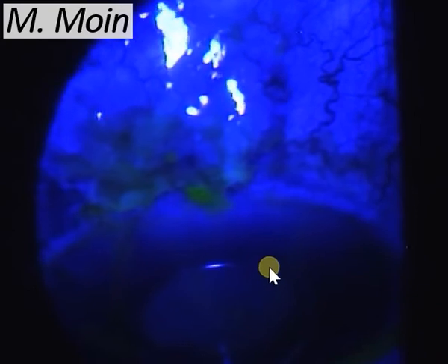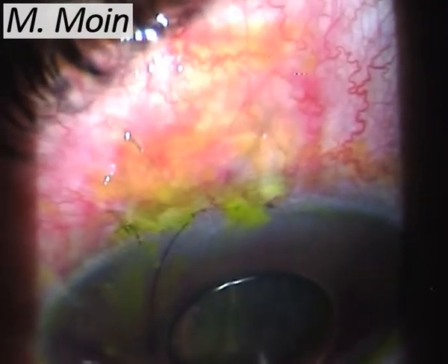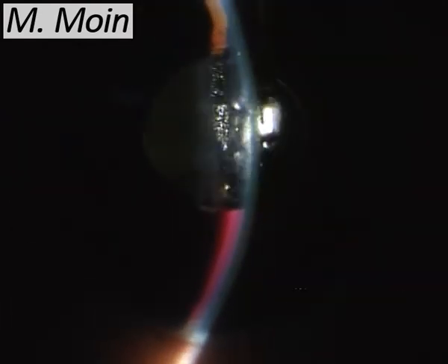So if I gently press on the eyeball, you can see this area. Even without fluorescein, with blue light, cobalt blue light, you can see or appreciate that area of leakage from the bleb. So this patient had a mild Seidel positive test with hyphema and a flat anterior chamber. So this is something which you do not want to see in your patients with glaucoma. So you're stuck. What do you do with this patient?